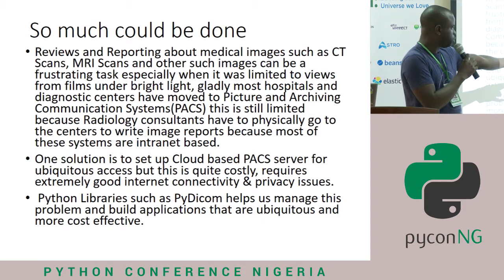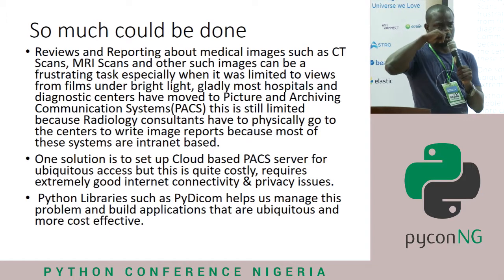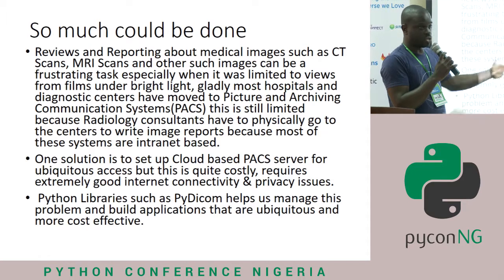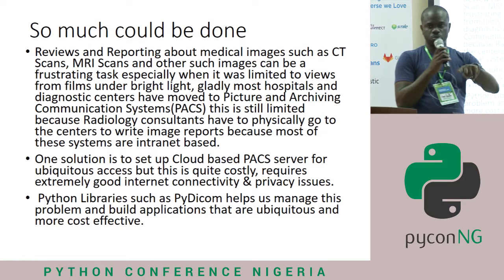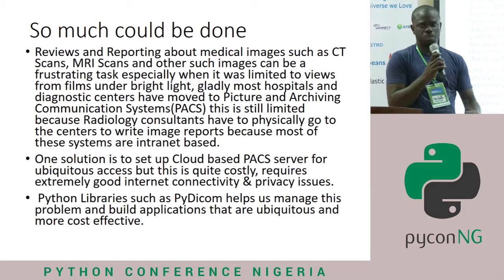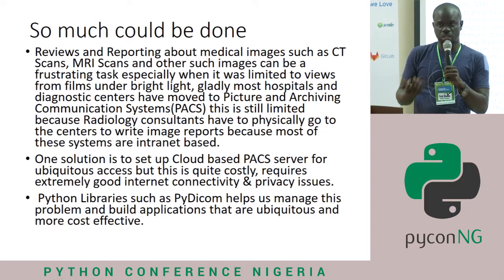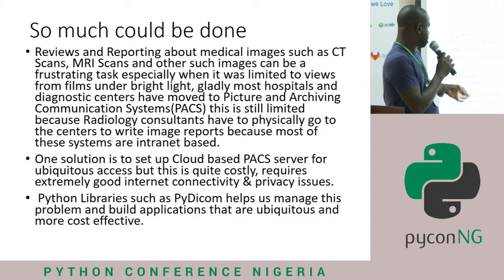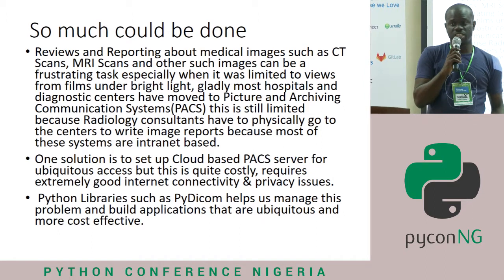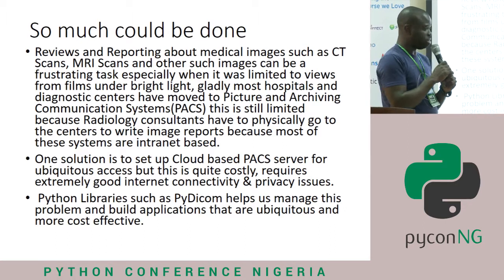One solution would have been to move the PACS server up in the cloud, with what that entails for ubiquitous access, such that consultants don't have to go from hospital to hospital or diagnostic center to diagnostic center. But that's a bit costly because image files are large. By the time you store a couple of images, you are consuming so much cloud space. Then also internet connectivity: good internet in Nigeria is not cheap. So you're going to incur a lot of cost handling images on the cloud.